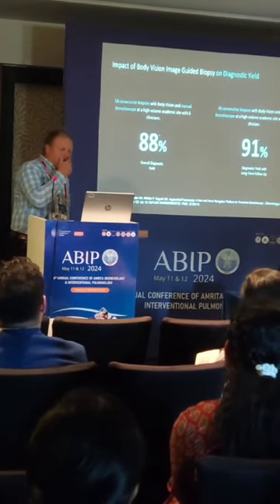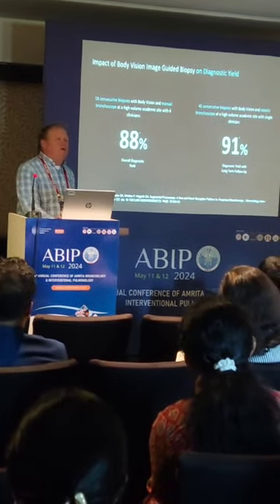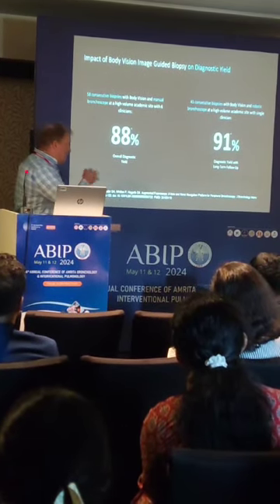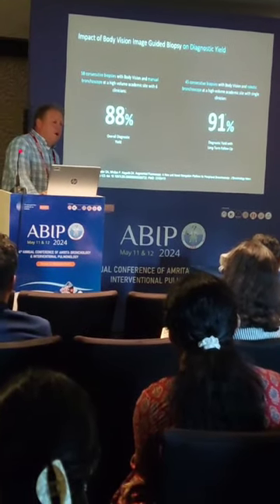And the nice thing about this is that it's agnostic to what you're using. You want to use it with a robot? Go ahead. You want to use it with a thin scope? Go ahead. You want to use their catheter? Go ahead. Doesn't matter. And the other nice thing from an economics perspective is it was a one-time cost. After that, it hasn't cost us anything because I don't use their disposable. So it just takes the catheter.